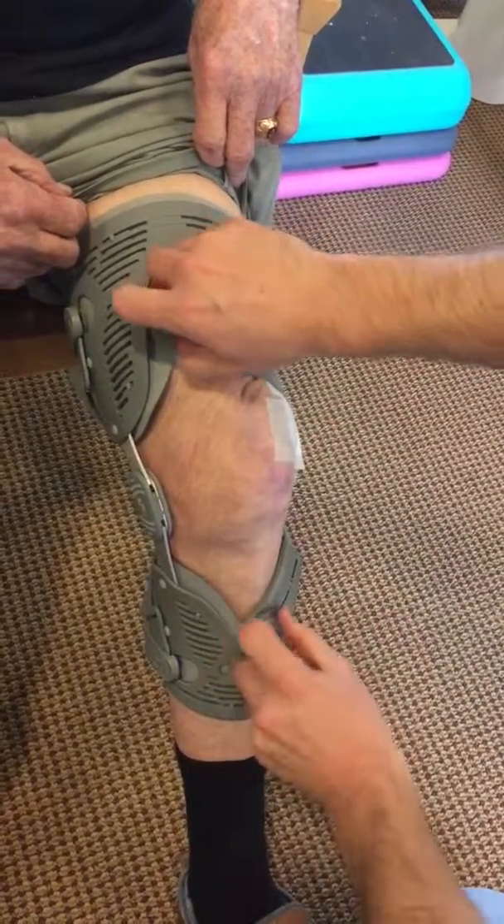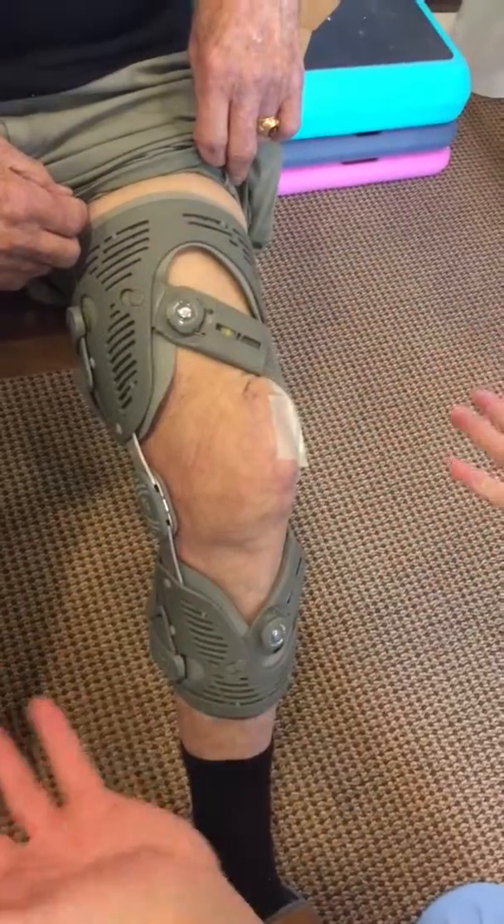You have to chase this thing every day. And that is it for putting it on. You may have to break it down.